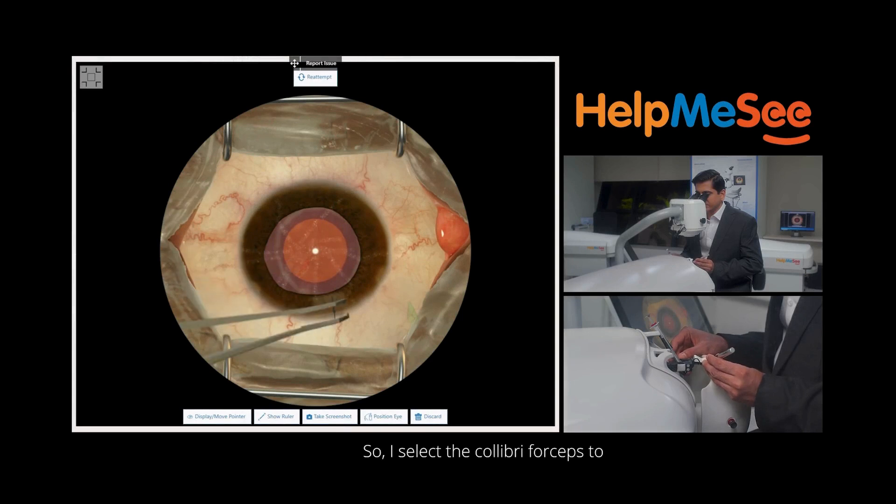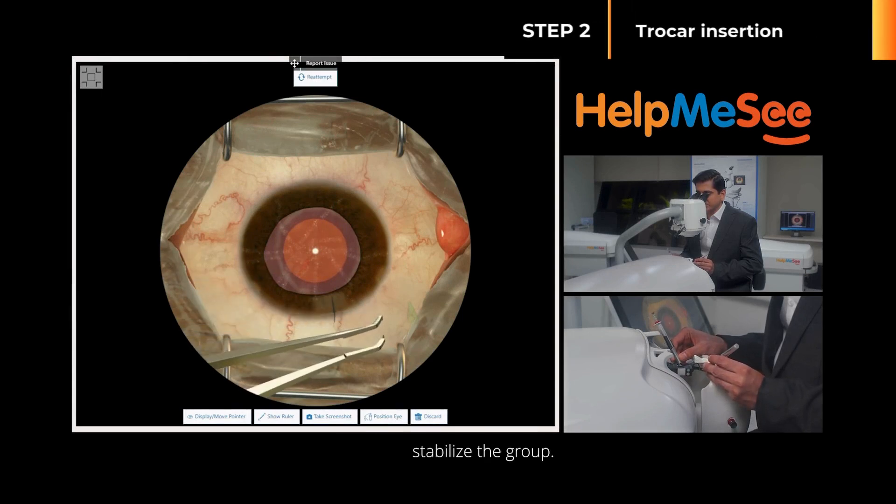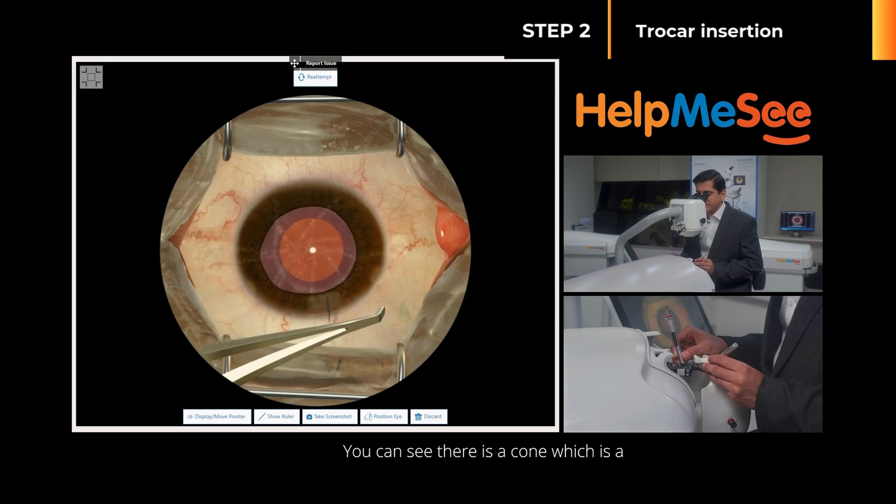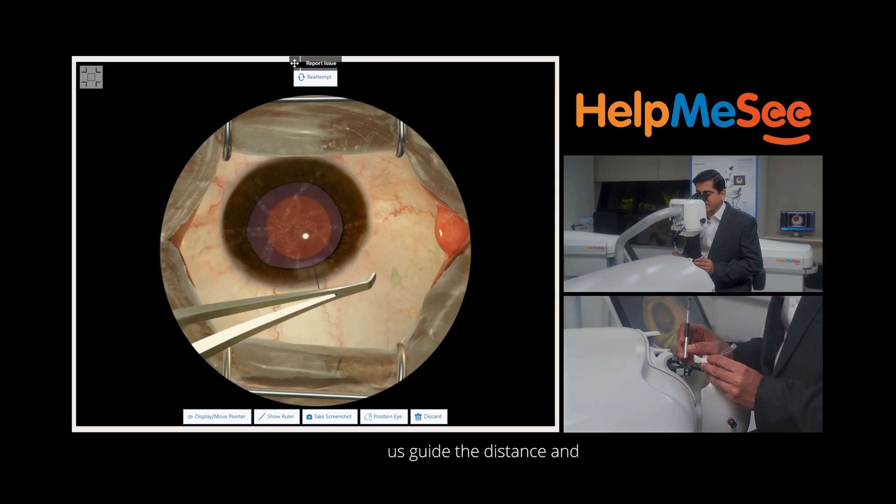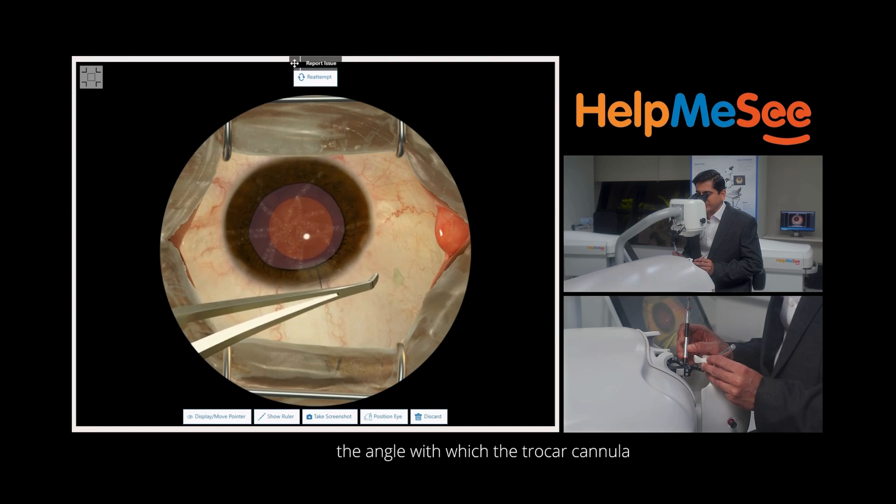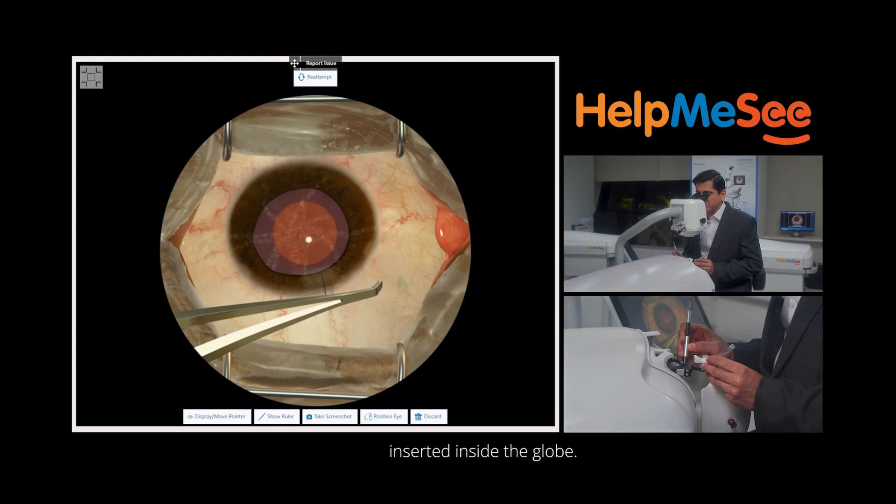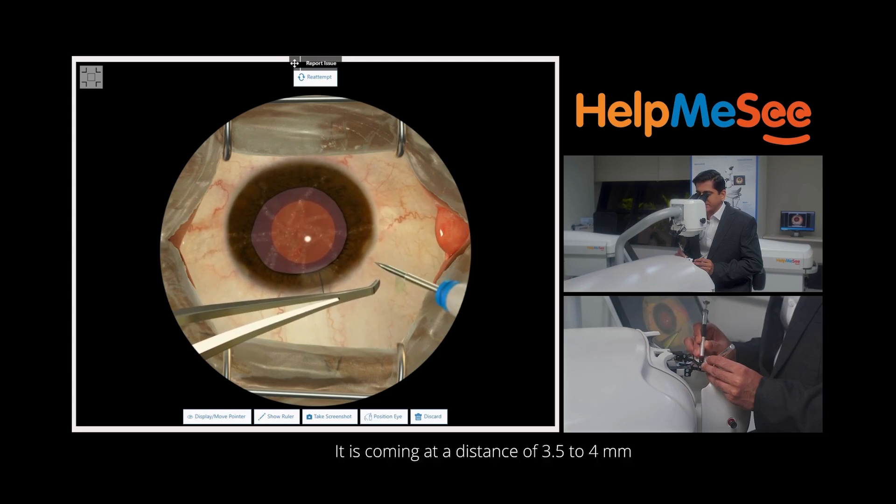I select the colibri forceps to stabilize the globe. You can see there is a cone which is a training tool which helps us guide the distance and the angle with which the trocar cannula system should be inserted inside the globe. It is coming at a distance of 3.5 to 4mm away from the limbus.